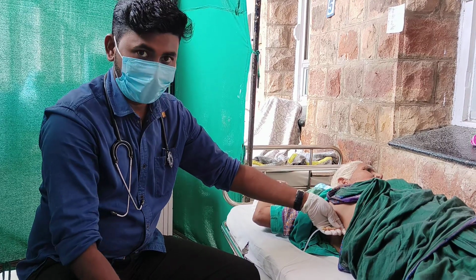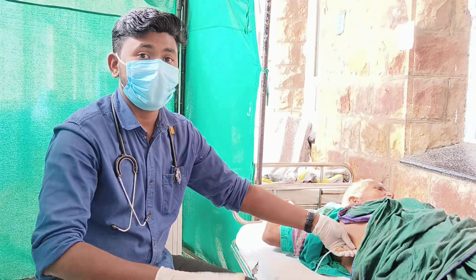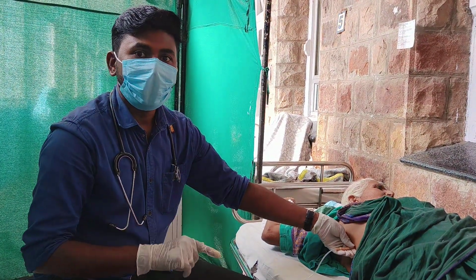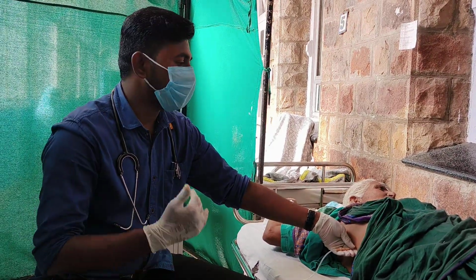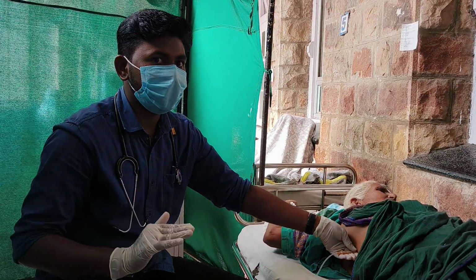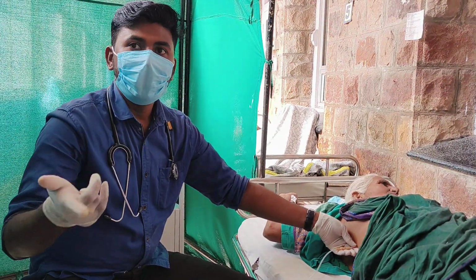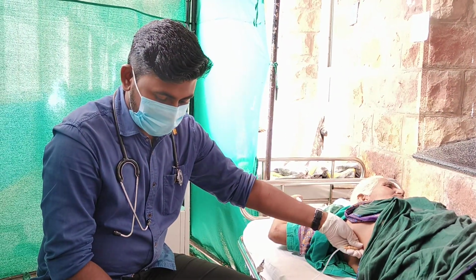If you take one bottle, this is called a layman's method. You can do this procedure anywhere. This is very important. This is a life-saving procedure, but it is not the final treatment. After doing this, as the air is coming outside, the patient feels better and comfortable. After that, we have to shift the patient to the hospital for ICD insertion. So this is the procedure.